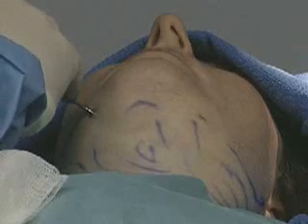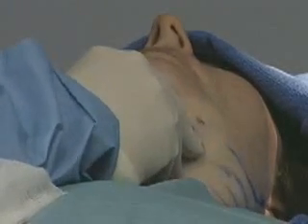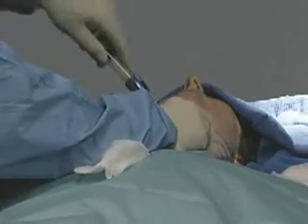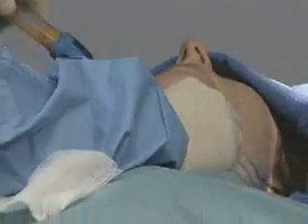Now I'm just taking this almost like an iron and gently dissipating this fluid so that it's in there all at the same level, more homogeneous. It's not lumpy. We can better assess the extent of our liposuction. So now that she's numb, we can just put this underneath, and we're just going to kind of run it under the skin, right between the skin and the muscle. You can see that it's filling up with just a yellow material with absolutely no blood in it at all. It's amazing how profound the anesthesia can get in just a few minutes.